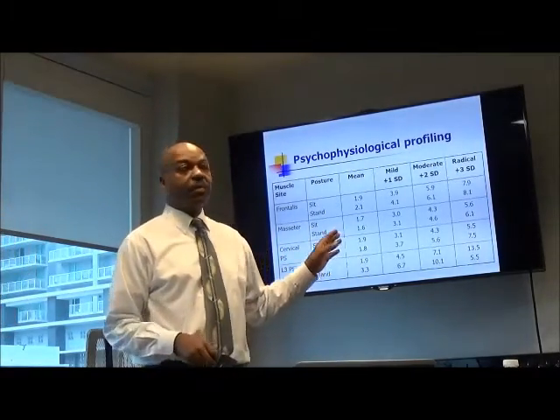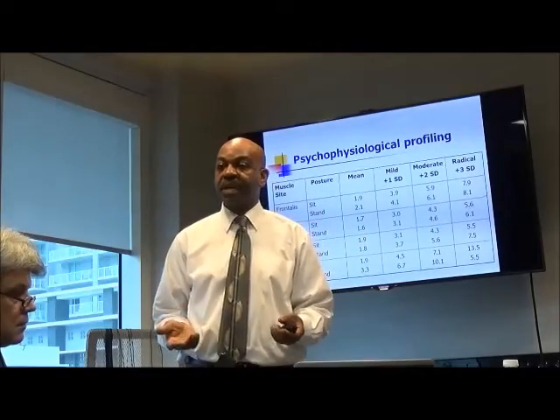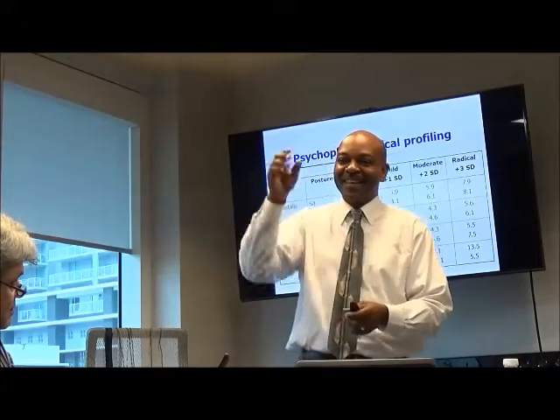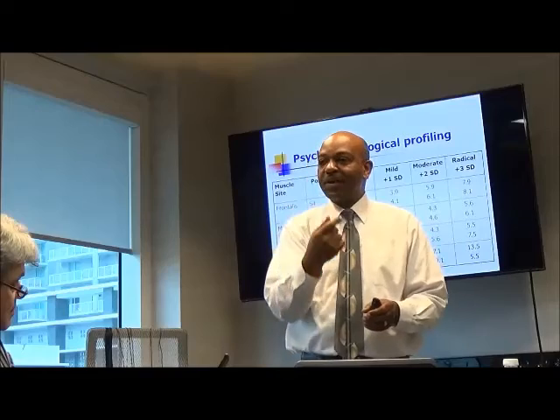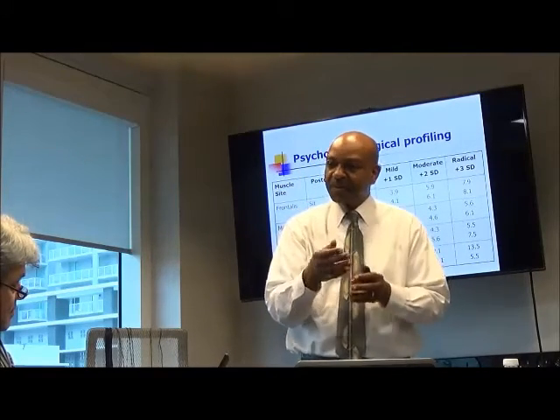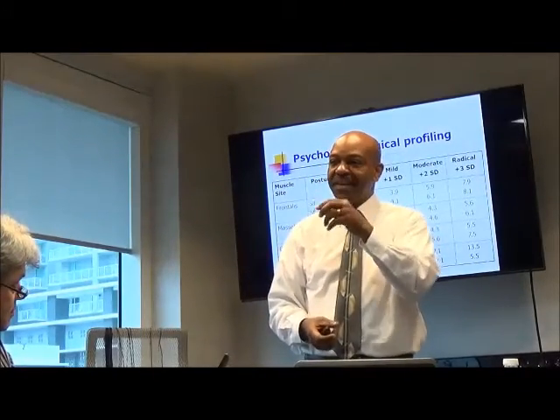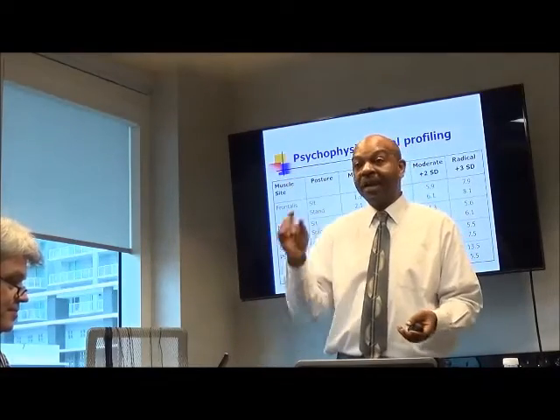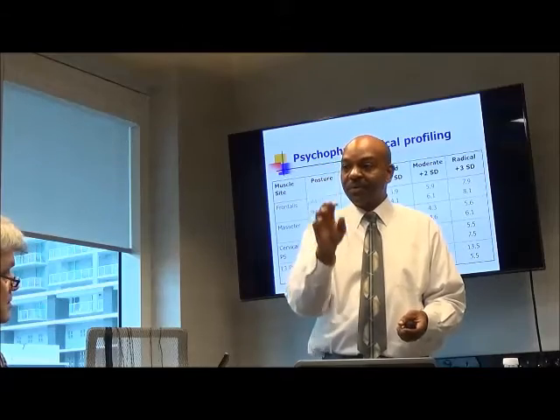Right. Now, part of what he was doing here is he also had something called muscle scanning. What happens is it gives a nice graph, it shows a picture of the back, and it has color-coded the areas that are more tense and the parts that are within normal range, and they show the spots that are more tense as the areas that need work. And it did a nice printout, and if there were areas that had more tension than others, it would highlight them.